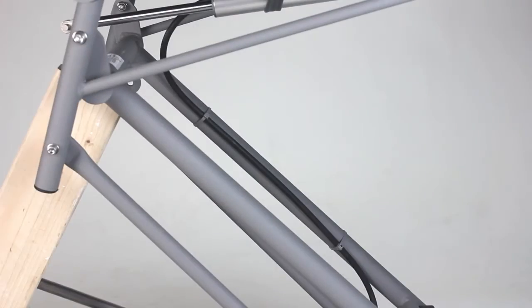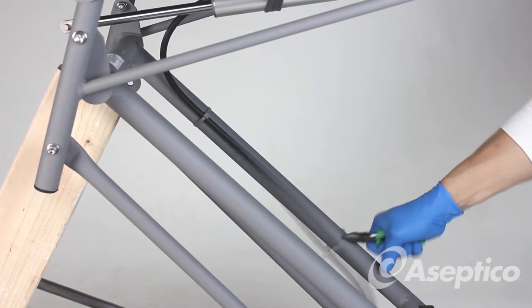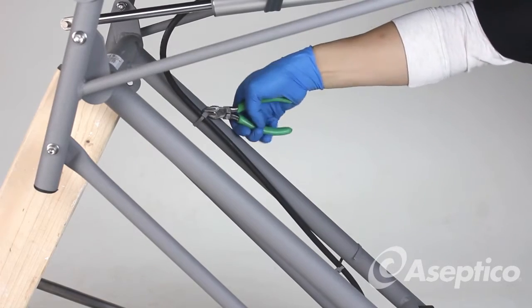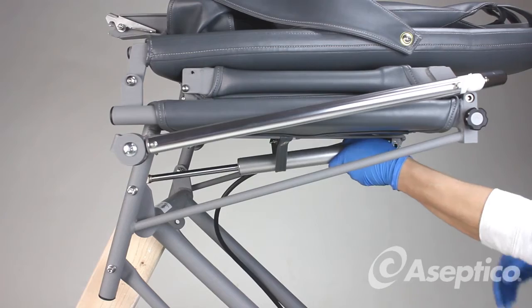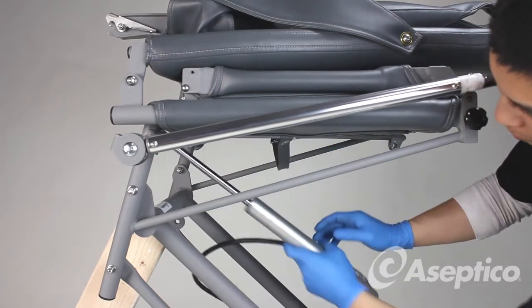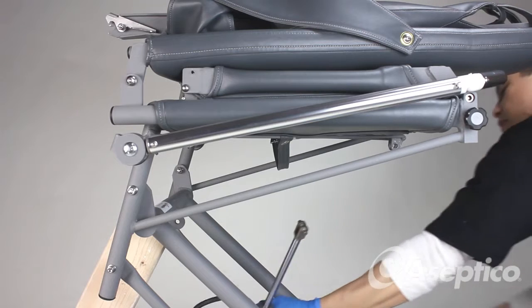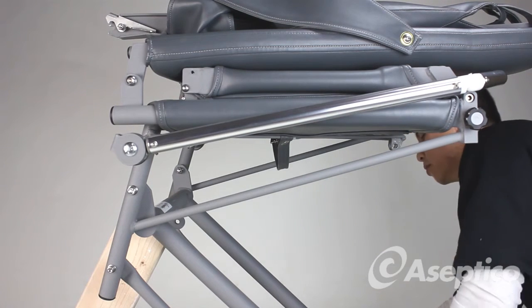To remove the backrest cylinder, cut the zip ties. Then slide it back out, through, under, and onto the floor.